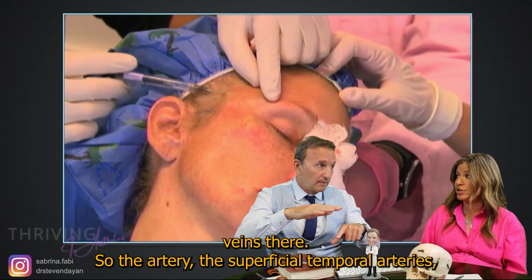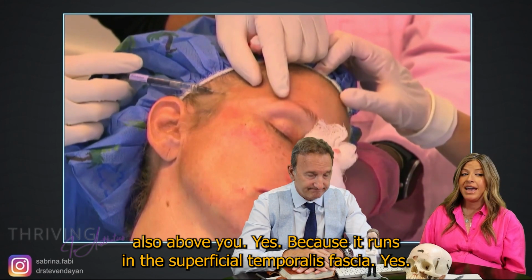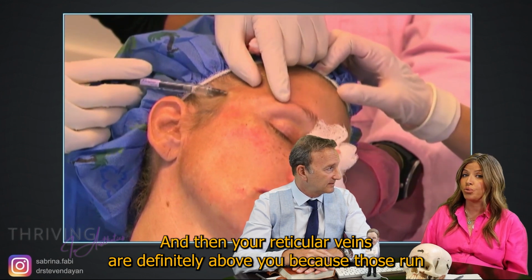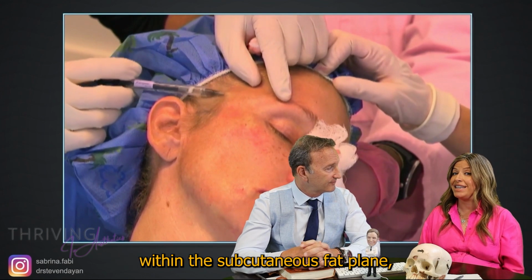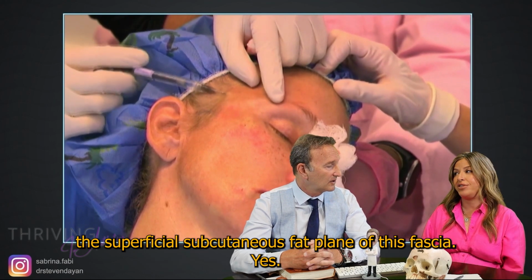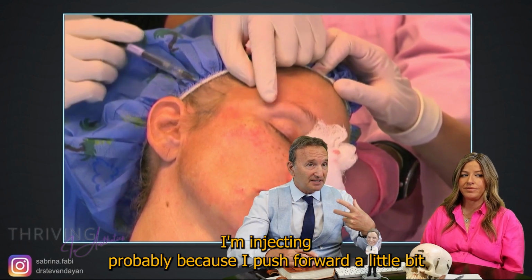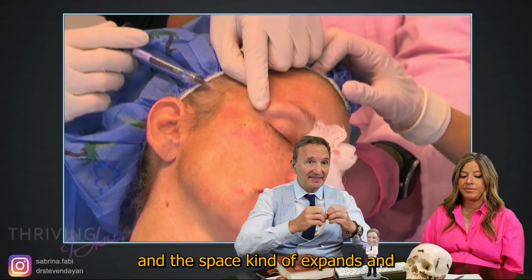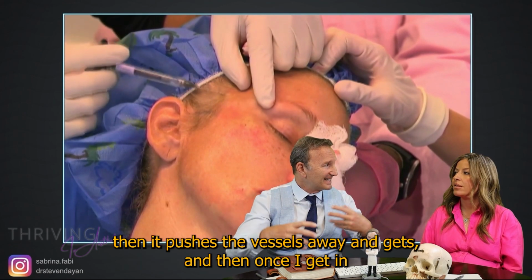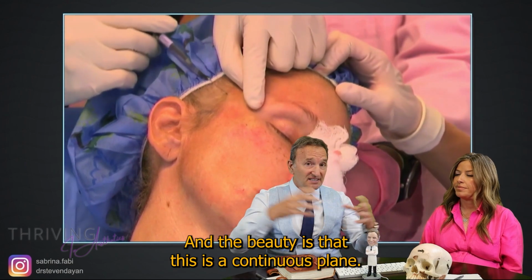The superficial temporal artery is also above you because it runs in the superficial temporalis fascia. Yes. And then your reticular veins are definitely above you because those run within the superficial subcutaneous fat plane of this fascia. Yes. And when I'm in this plane, I'm pushing forward, I'm injecting product as I push forward a little bit, and the space kind of expands, and then it pushes the vessels away, and once I get in there, it gets a lot easier, and it can just expand more. And the beauty is that this is a continuous plane.